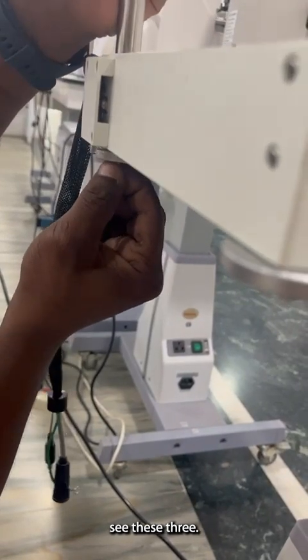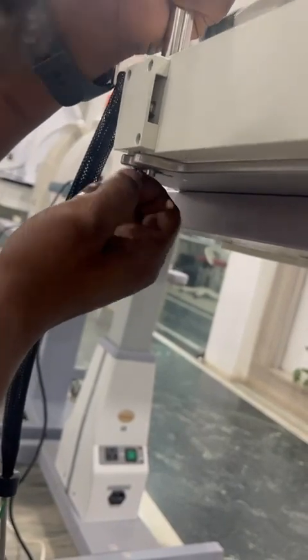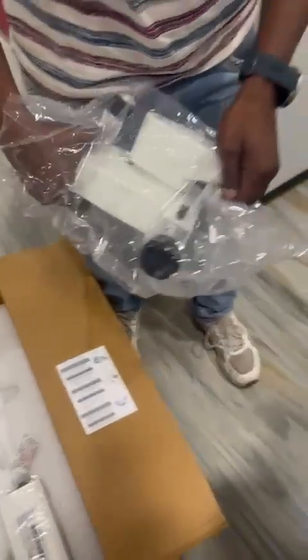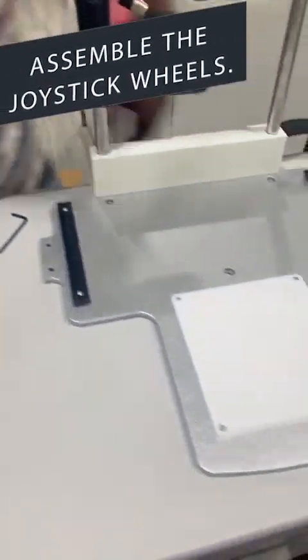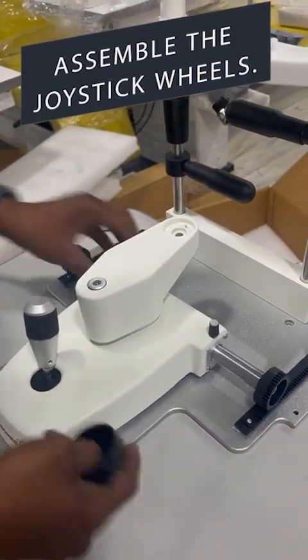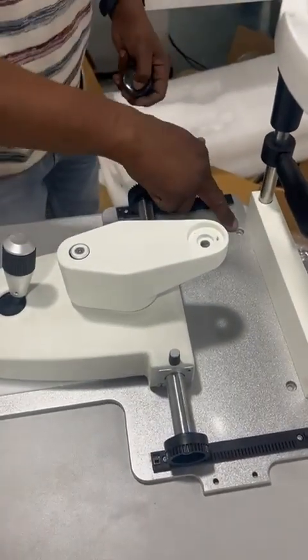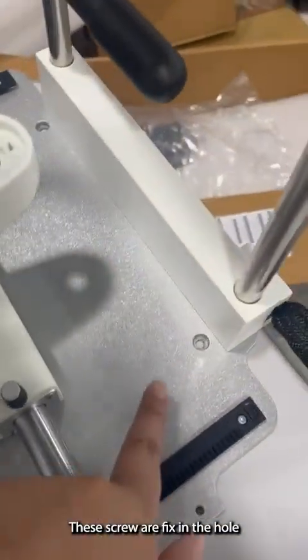Do the same on the other side. These screws are to be tightened into the board.